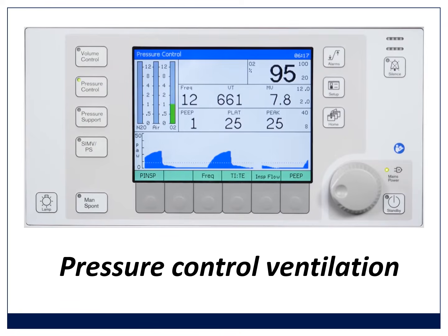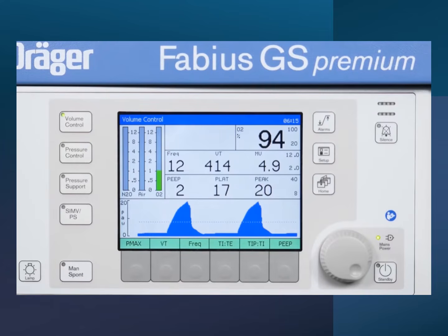If you look at pressure control ventilation, here the light for pressure control's on. There they've set a peak pressure of 25. So every single time the ventilator is going to give 25 pressure. And notice now it's delivering 661 mils. So that 661 is what that pressure generated. The minute ventilation is 7.8. The frequency was set by the user because this is mandatory ventilation. So those are the two modes, pressure and volume, and those are the things you've got to watch.